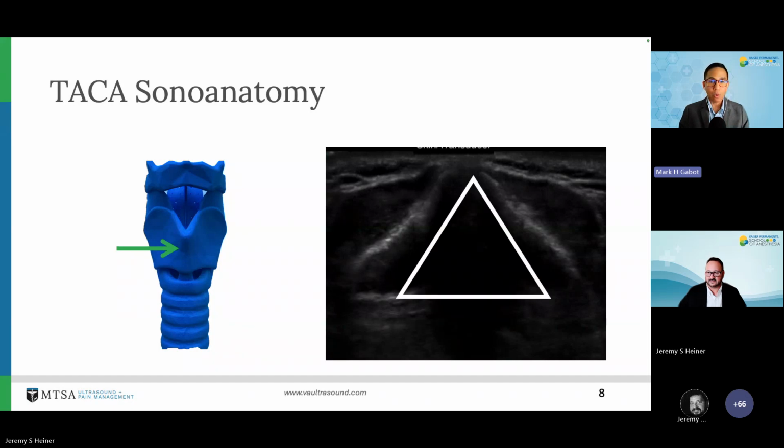So just remember it's sort of a V shape. Here we have it as more of a triangular shape. So we have that V characteristic with it. The anatomical model on the left helps us correlate what we're actually seeing on the ultrasound in relation to the actual patient anatomy. Just for the future slides, as we move through the images, you'll see how these structures change as we scan again from cephalad to caudad, or from the head down to the feet. Next slide, please.